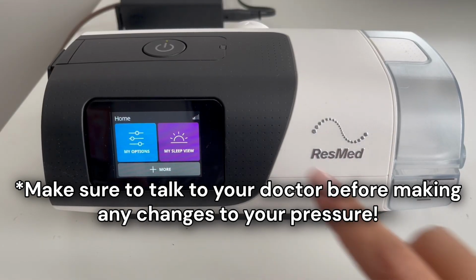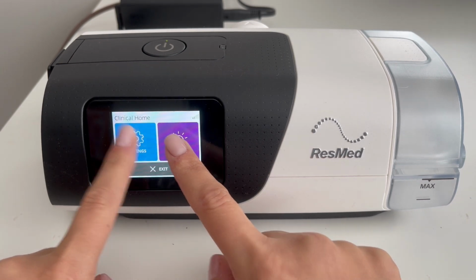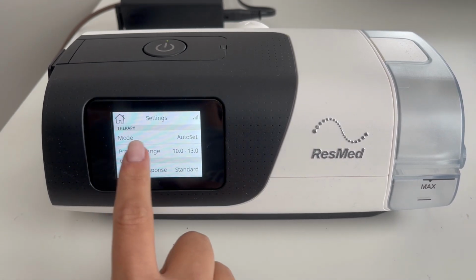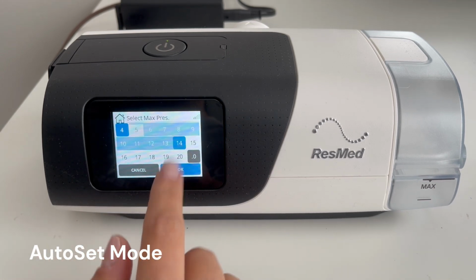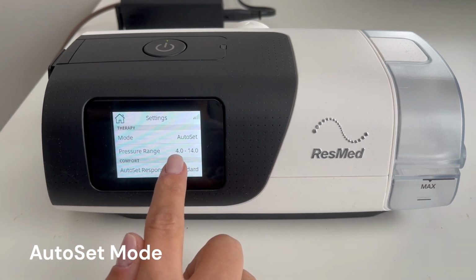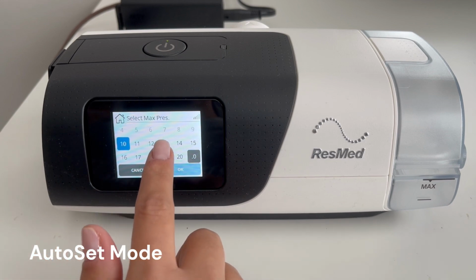Learn how to change the pressure settings on an AirSense 11 in this video. First, start by pressing the purple and blue buttons at the same time to access the clinical menu. Click Settings and you will see that the machine is currently in AutoSet mode, meaning the pressure range will automatically adjust depending on your changing needs at night. Click into Pressure Range and choose the min and max pressures to accommodate your personalized breathing needs.